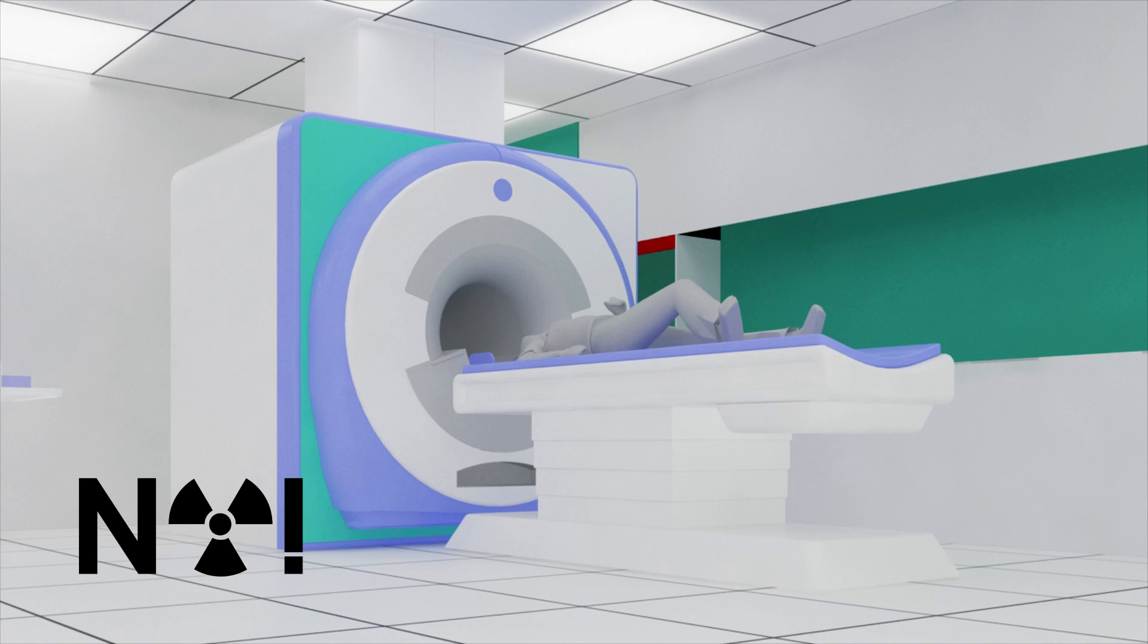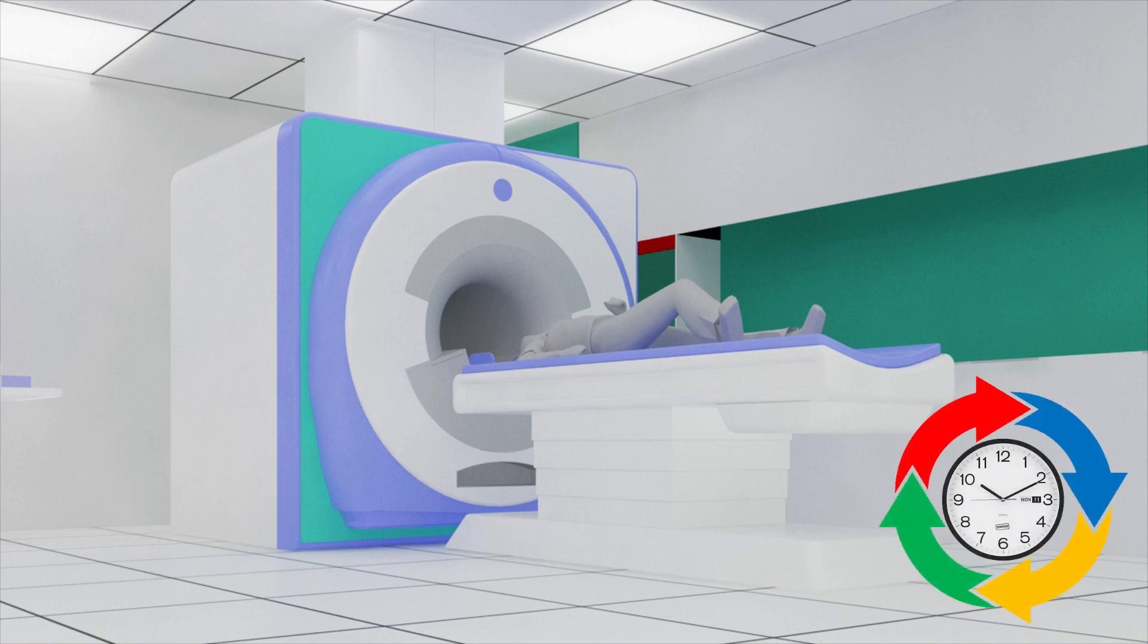Magnetic resonance imaging, MRI, is a non-invasive way to view organs and does not use radiation. It gives extremely clear detailed images of soft tissue structures. But on the other hand, MRI examinations are long because it is needed to acquire sufficient data to build a complete image.